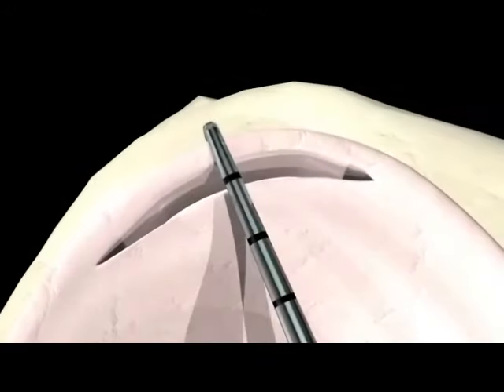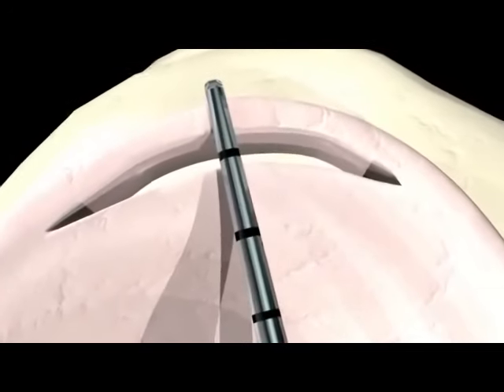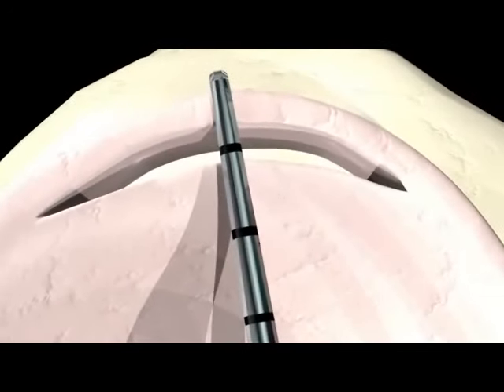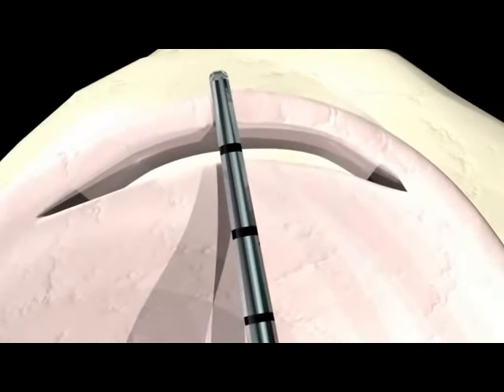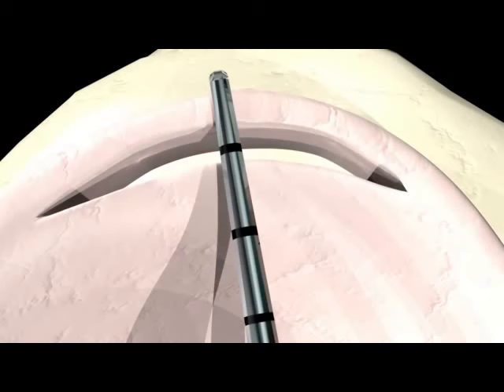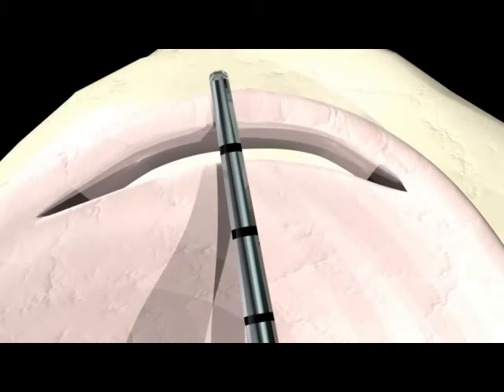Record the intended depth of penetration at the repair site. This will serve as an indicator as to how far to advance the AS meniscal repair device and help gauge proper penetration of the tissue.